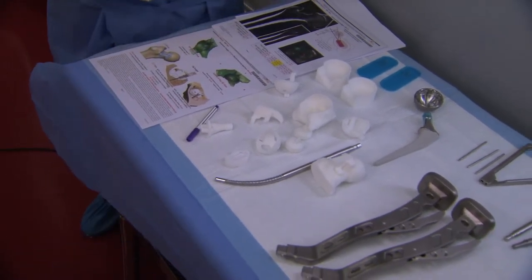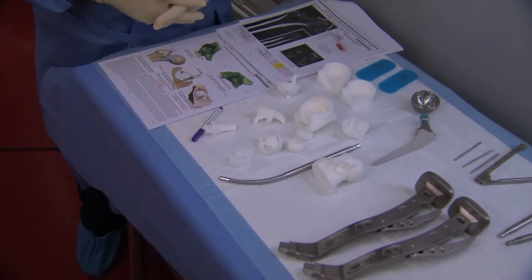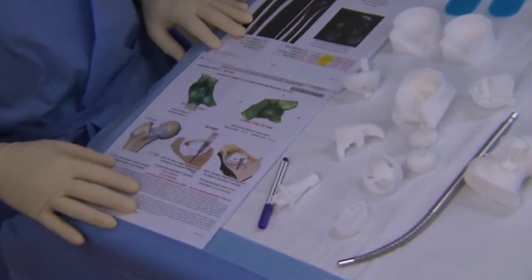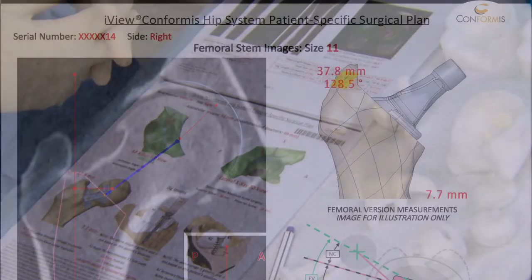Today we're going to be performing the hip utilizing the HANA table and using a direct anterior approach. I'd like to point out some things on the iView, which is the preoperative plan, which the surgeon gets ahead of time and approves.